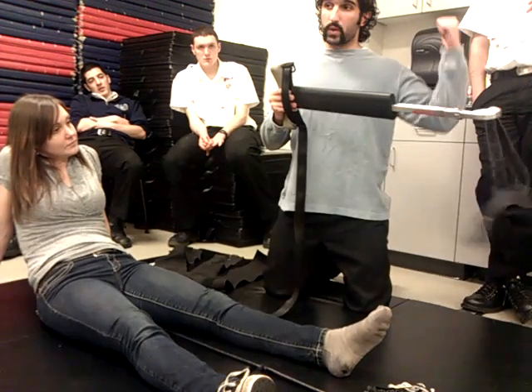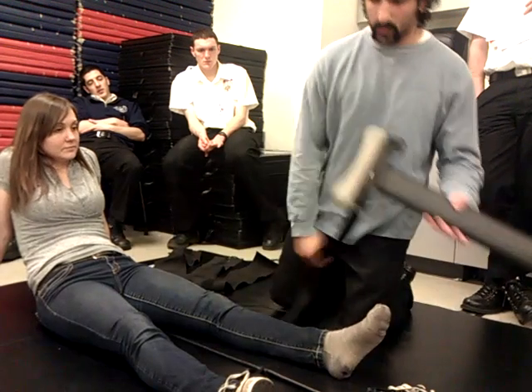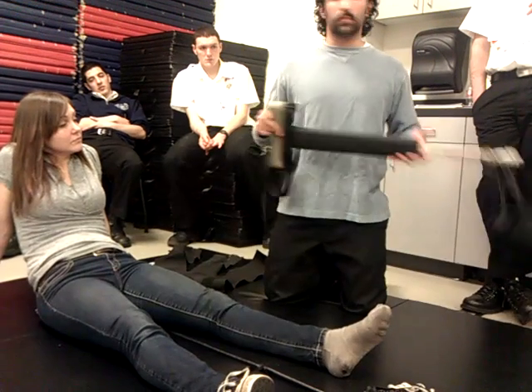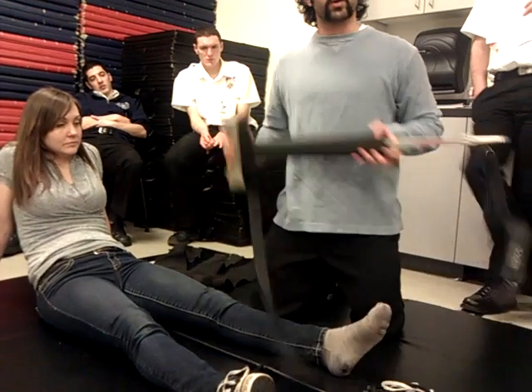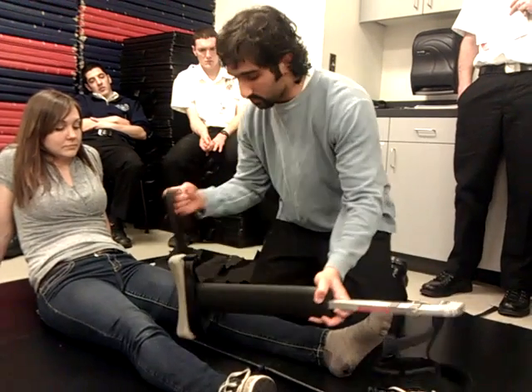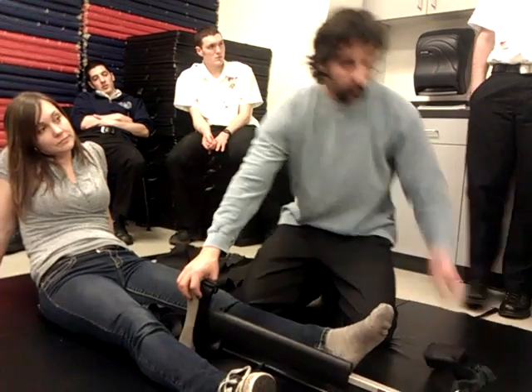gauge is pointing laterally. For this particular device, you're not going to be measuring it until the device is already on the leg. The Hare, you measured beforehand, right? For this one, you're sliding it in between the leg. Again, you're not going over the patient, you're not going over their head, you're going around their leg, and you're going to slide it into place. Another difference from the Hare is that you're not pulling manual traction on this station. Right.